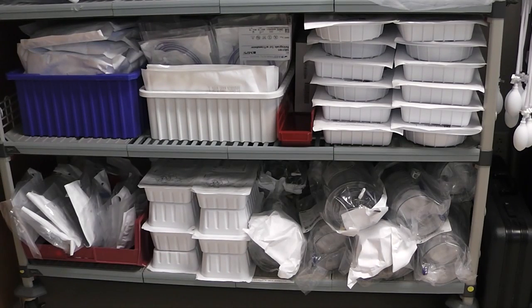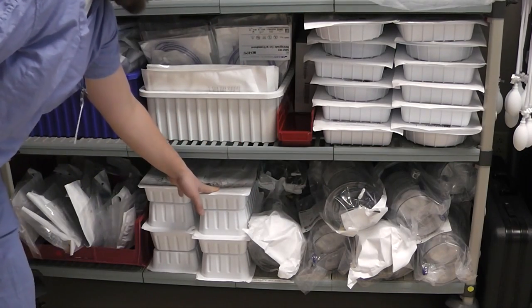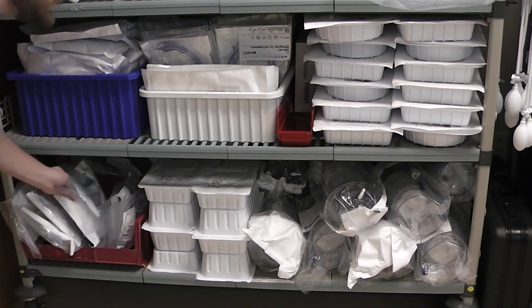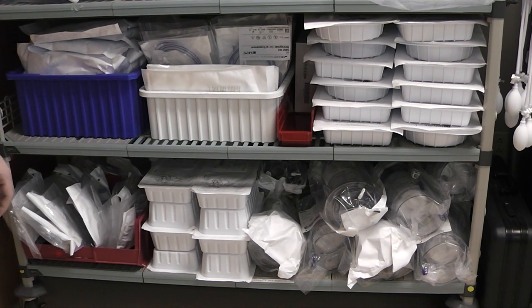From the supply wall we will need to gather five different disposables. We will need the reservoir, wash kit, table pack, filter, and a three liter bag of saline.